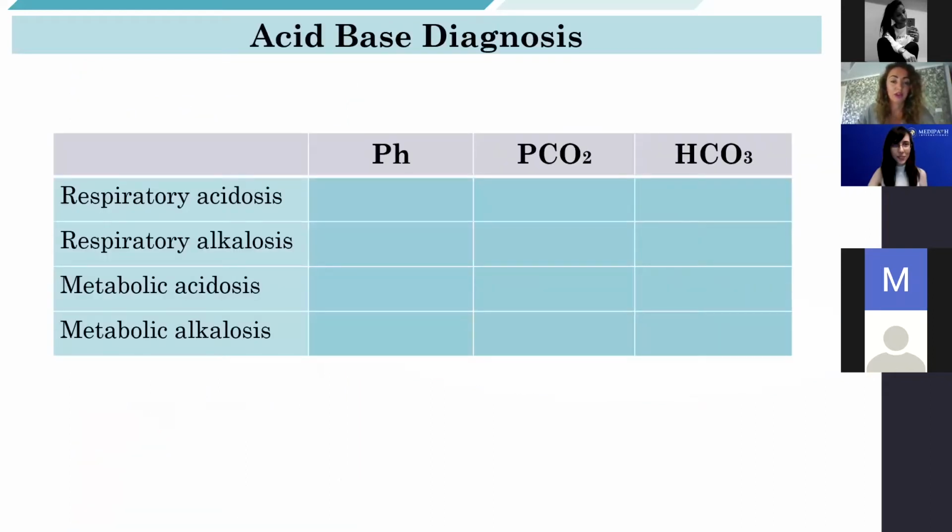This is a chart which illustrates 4 categories of blood gas diagnosis. So if you think of your patient as falling into one or another category, therapy can be simplified. Combinations can occur and require multiple regimens. So let's start with the respiratory acidosis.